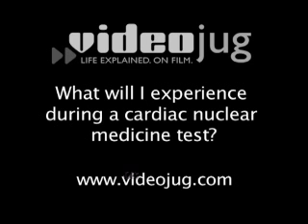What will I experience during a cardiac nuclear medicine test? The procedure itself doesn't really cause any specific types of sensations. Again, there may be a little pain at the time when the radiotracer is administered intravenously, but other than that, there is really no side effects associated with the radiotracers themselves. Very rare, as we talked about in the past. The patient just lies down, or sometimes in some cases they sit in a chair, and the camera system is around them and takes the pictures. There is really no specific sensation associated with that.